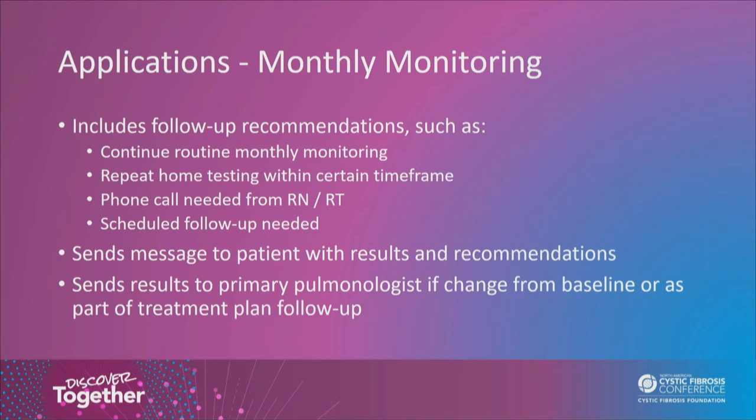In addition, within that encounter, I will provide follow-up recommendations. So, for example, if their FEV1 is stable, then I will recommend to continue routine monthly monitoring. However, if there is a change from their baseline, then I may recommend to repeat home testing within a shorter time frame, like 1 week or 2 weeks. I may recommend a phone call from the nurse so they can triage them, or with the respiratory therapist so that they can review their technique. Or lastly, I may recommend a scheduled follow-up with their provider.